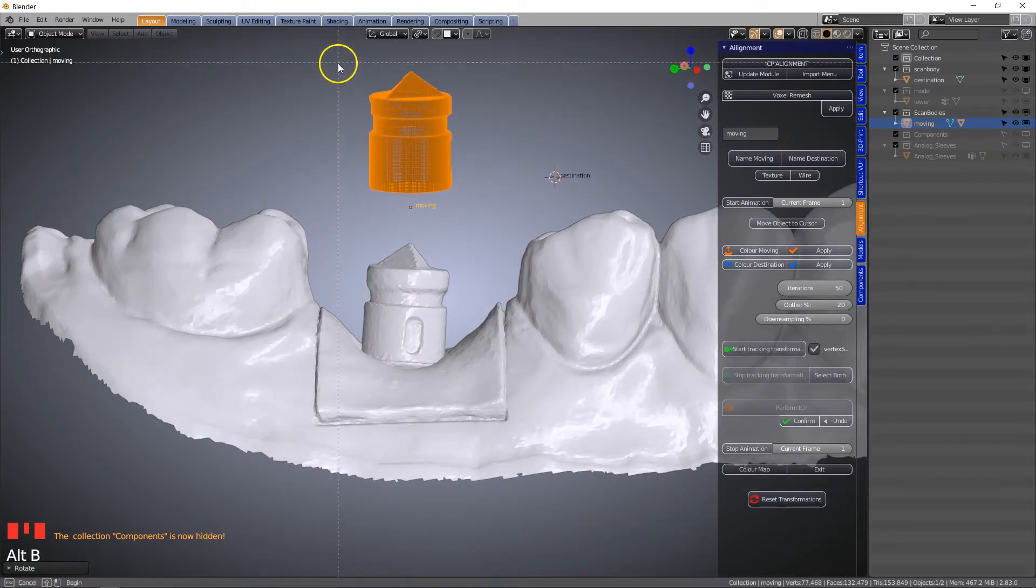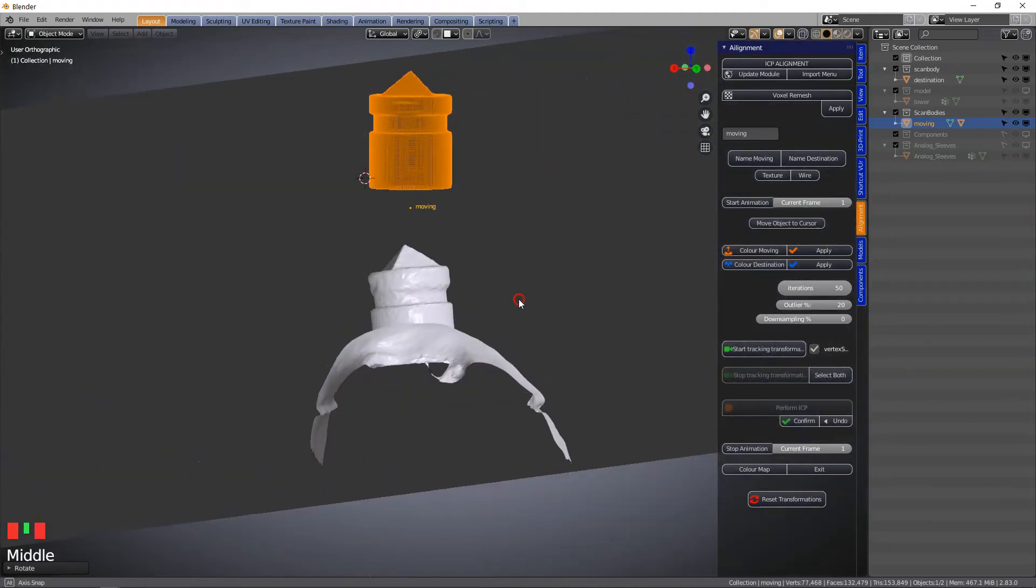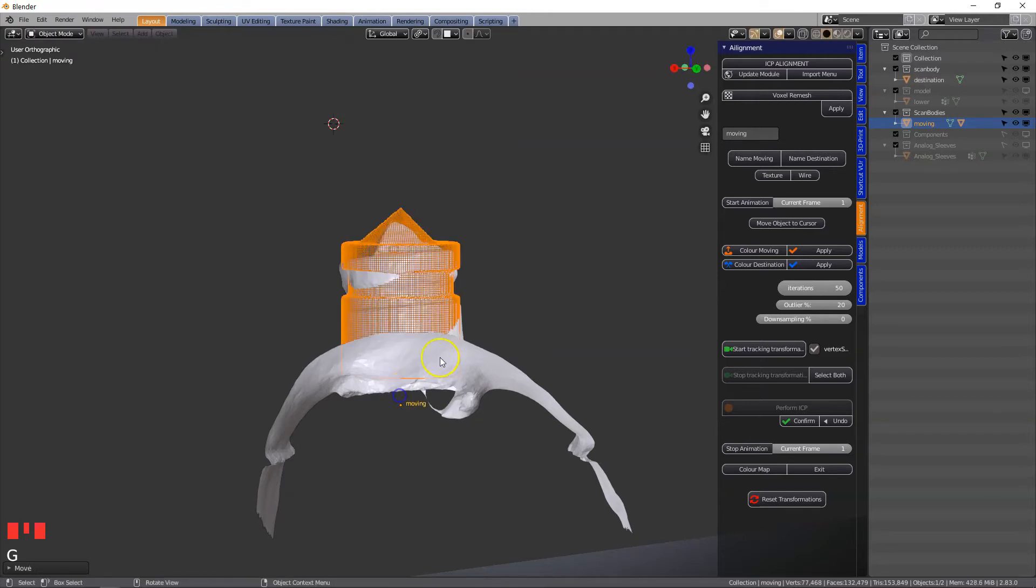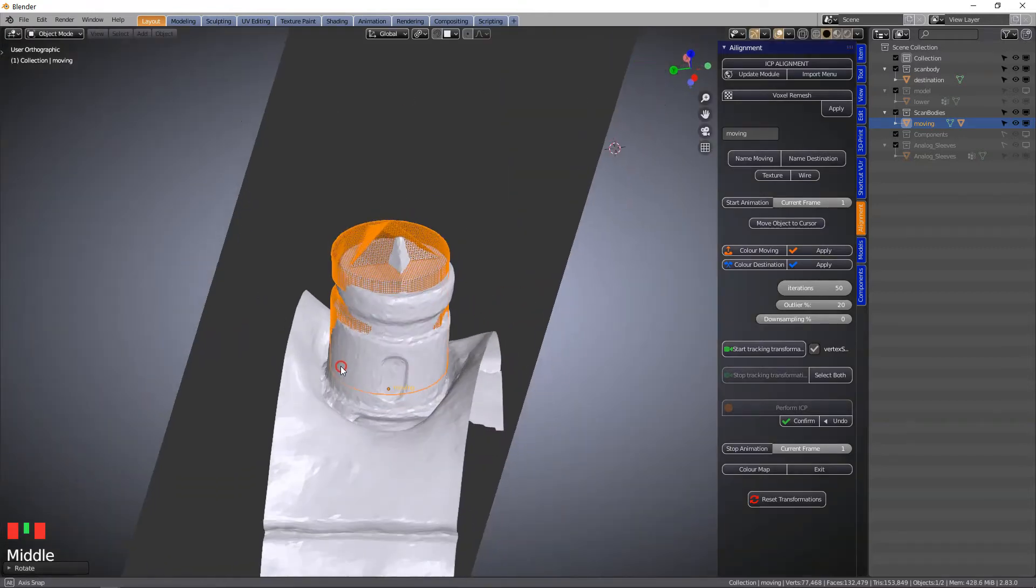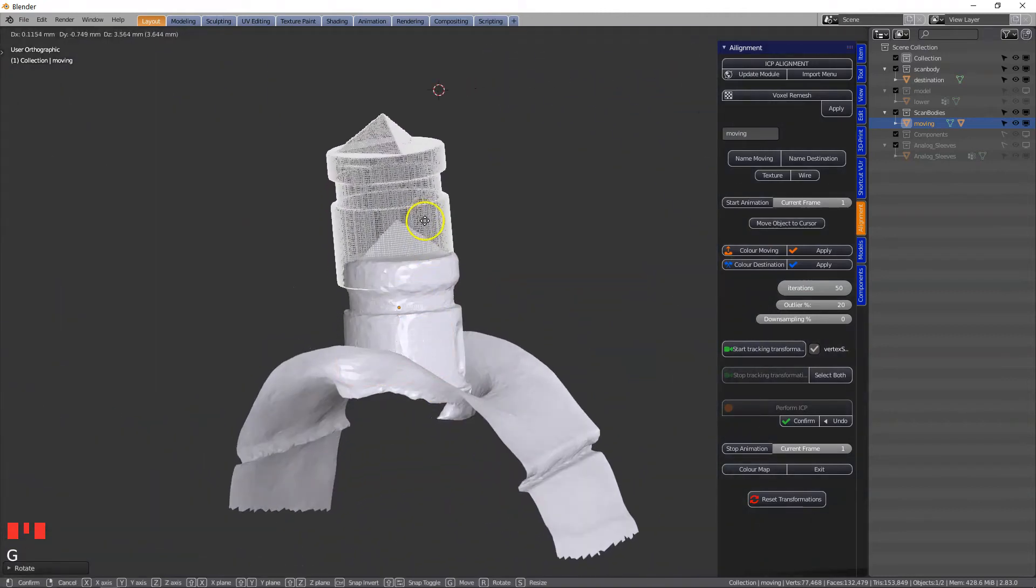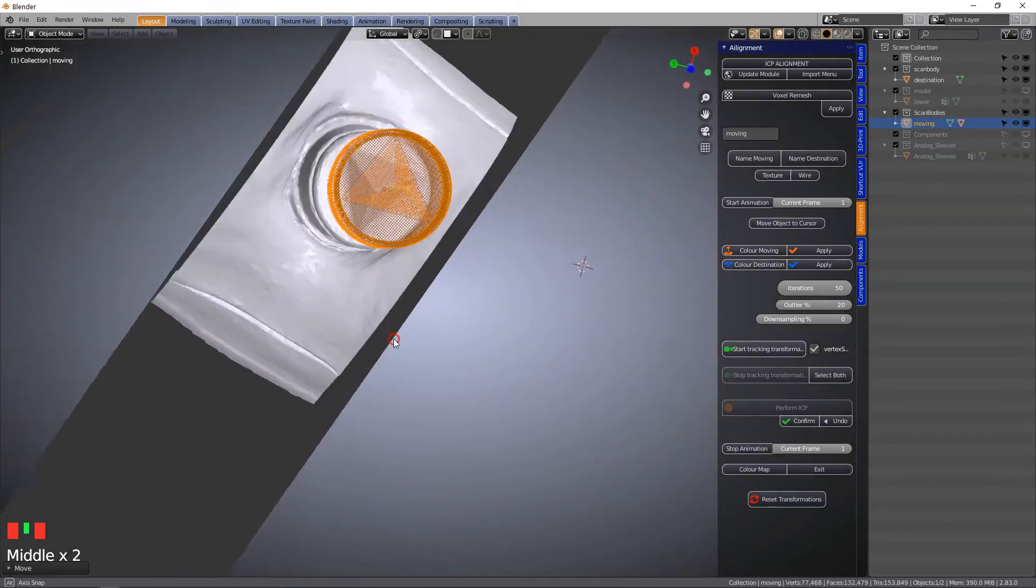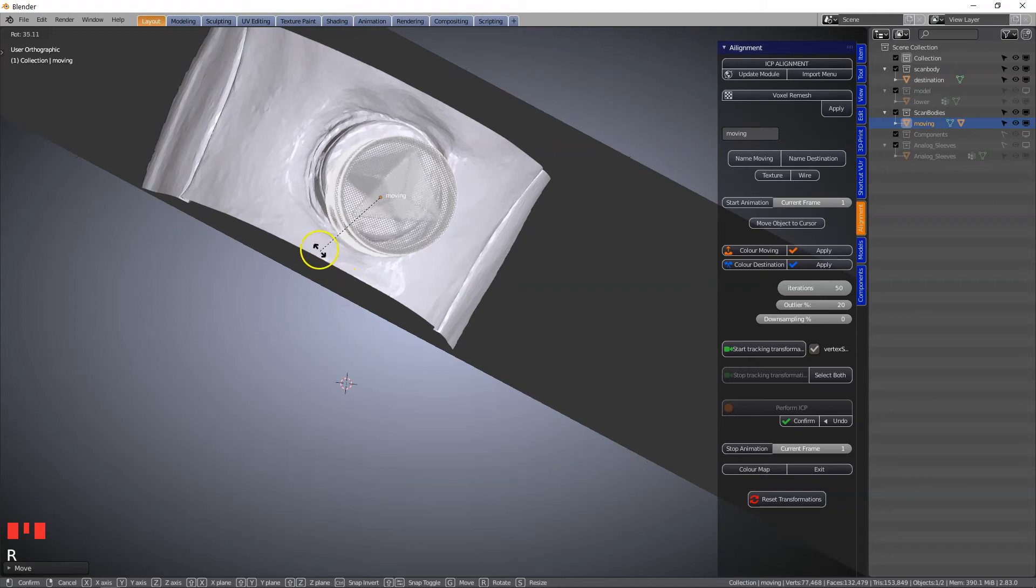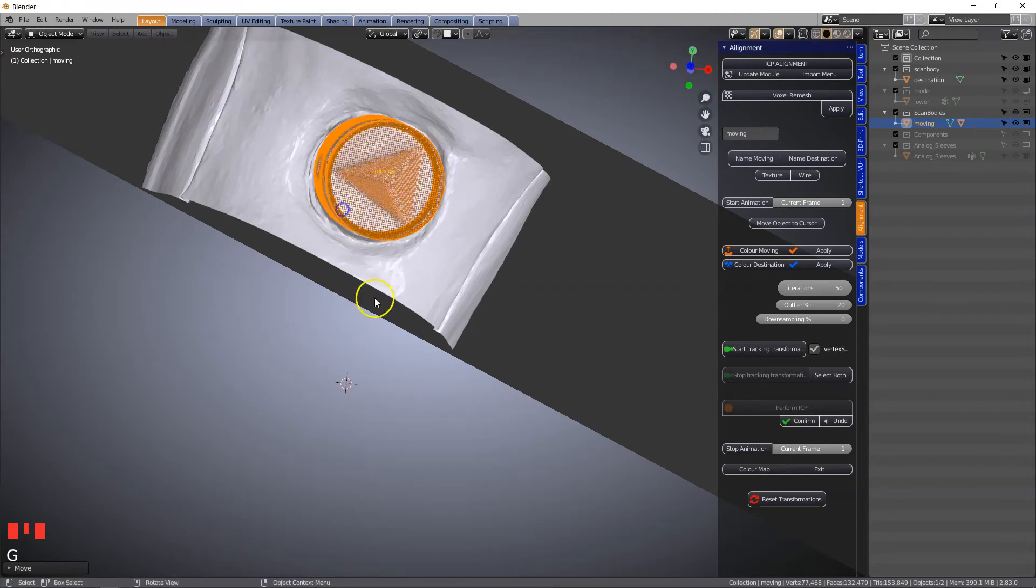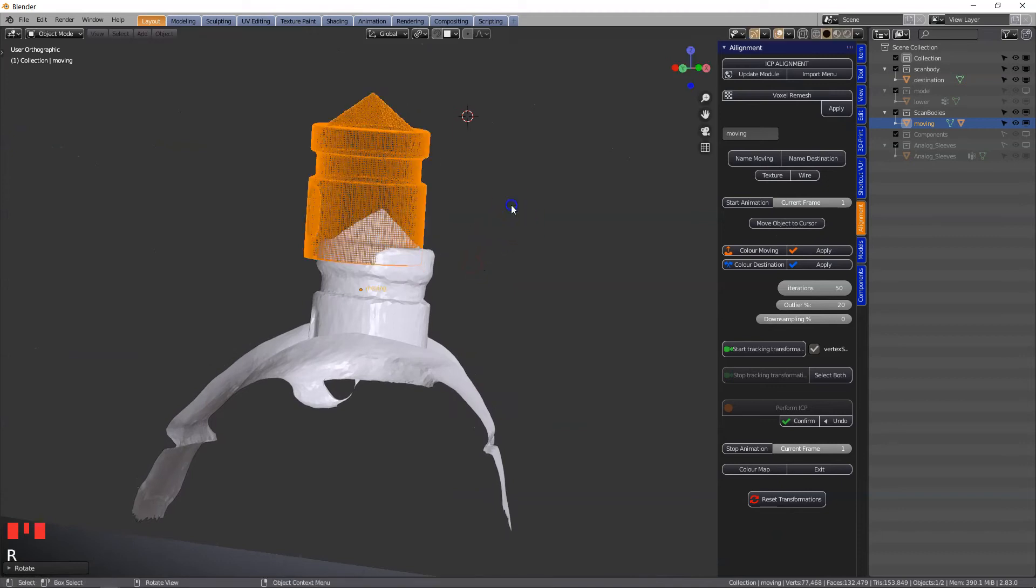Alt B to get a cross section, using the G key and the R key, making sure you've got it properly aligned. There's a little notch on one side so we have to rotate it a little bit. Using the R key rotate it and the G key to bring them into position.